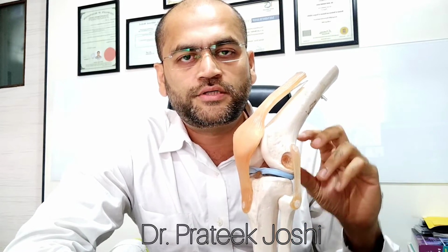So what happens is, when there is twisting injury to the knee joint, the femur rotates over tibia and it leads to shearing forces which can tear the meniscus or even tear the ligament which are inside the knee joint, such as ACL ligament over here.